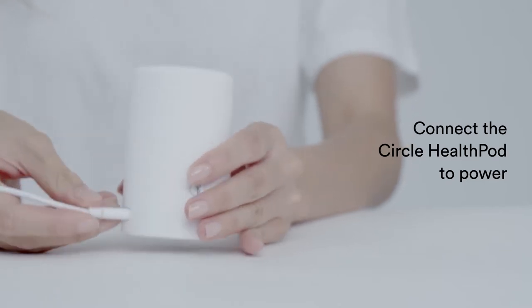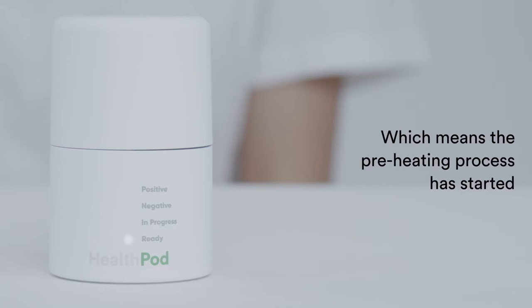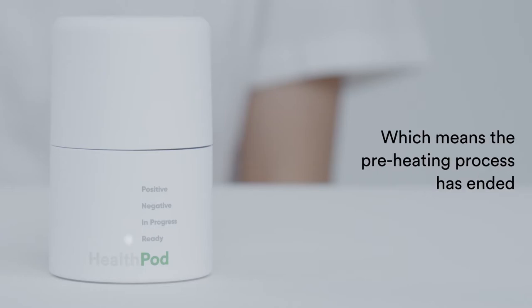Connect the Circle HealthPod to power. The ready light will start blinking, which means the preheating process has started. Wait for the ready light to stop blinking, which means the preheating process has ended.